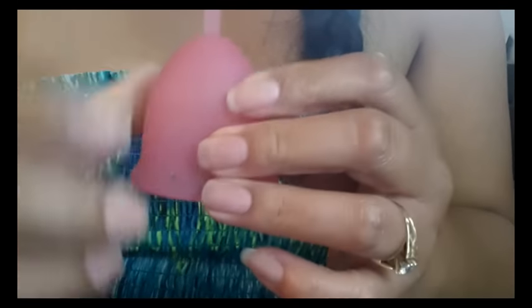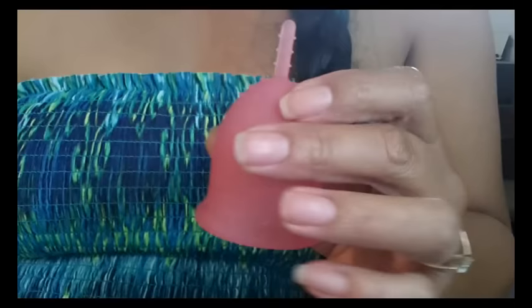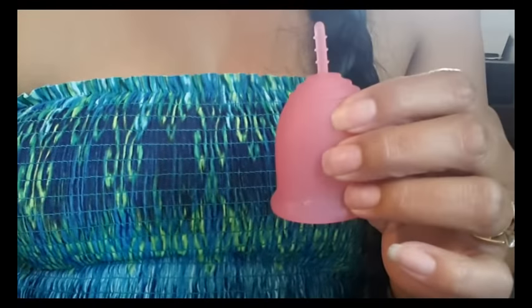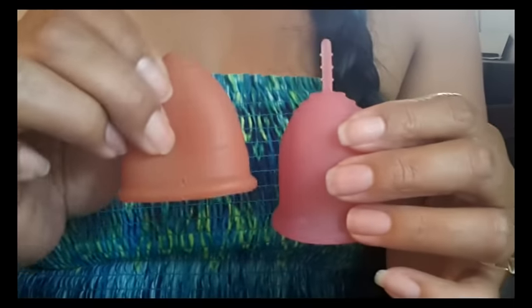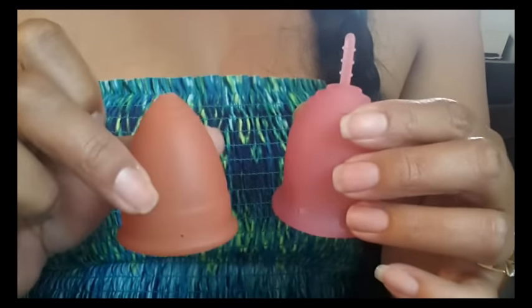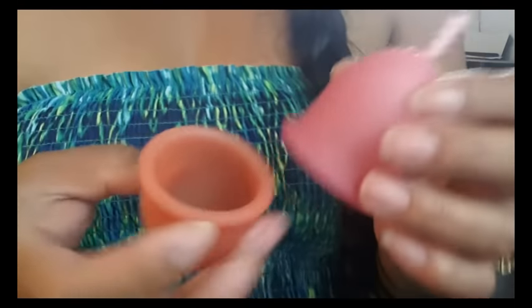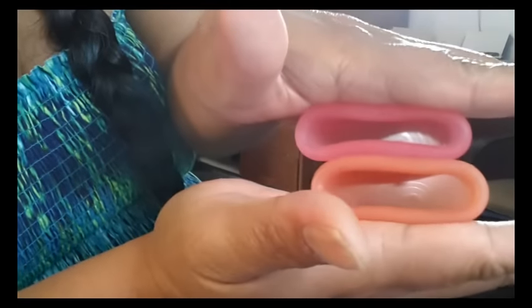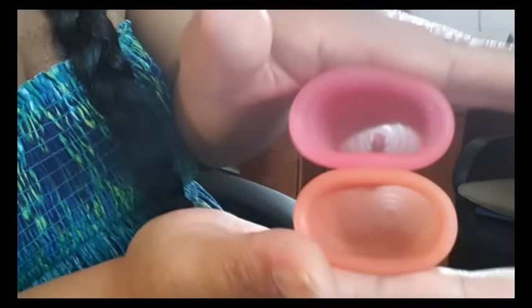I'll go ahead and compare it to one of the other cups. The cup that it's most similar to in resistance is the Lunette cup out of the cups that I have — I only have one cup that's more firm than the Lunette and that's the Yuki cup. I'm going to do a squish test between the palms of my hands. You can see that neither of them are bulging in the center, so they have a pretty similar resistance. The Lunette cup does have a little softer rim though.